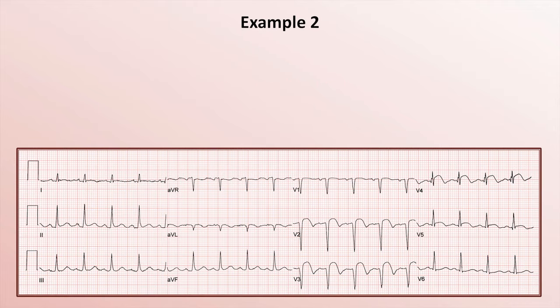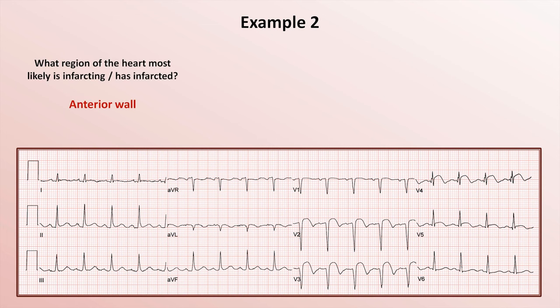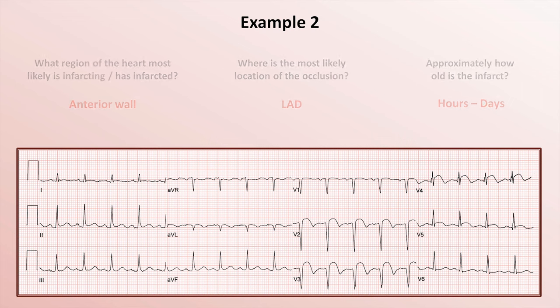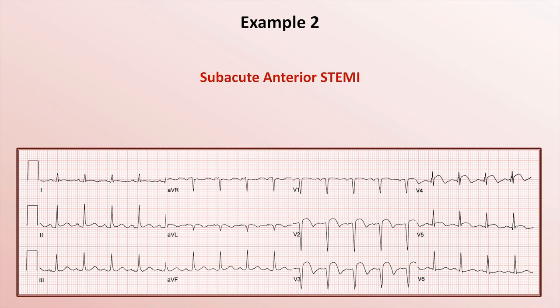In example 2, ST elevations are seen in V2 through V5, so the region that appears to have infarcted is the anterior wall, supplied by the LAD. Although many trainees assume that ST elevations suggest the MI is very acute, there are also pathologic Q-waves in V2 and V3. Since Q-waves take hours to days to develop, this infarct must be that old — ST elevations and Q-waves can co-exist during this window. Summary: this EKG shows a subacute anterior MI.